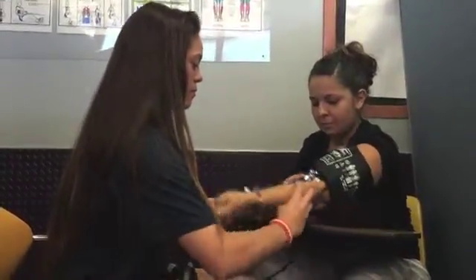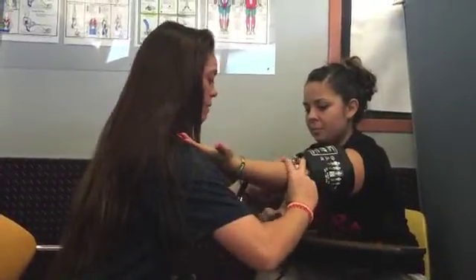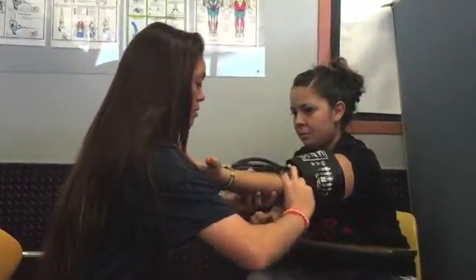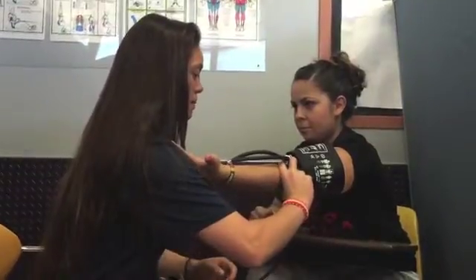Place the stethoscope chest piece below the antecubital space over the brachial artery. Also, make sure the patient's arm is dead weight. It makes it easier if you place the patient's arm on your shoulder.